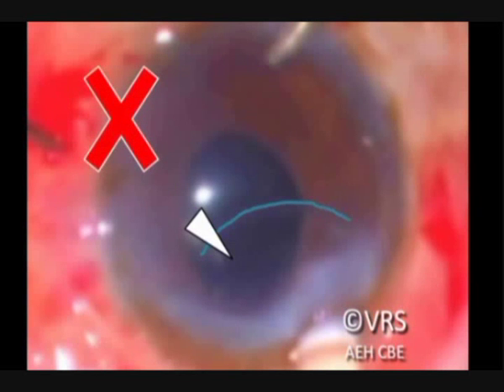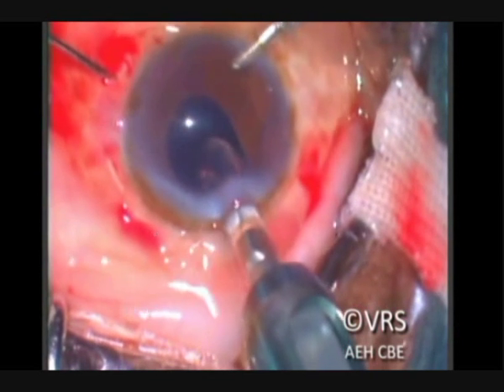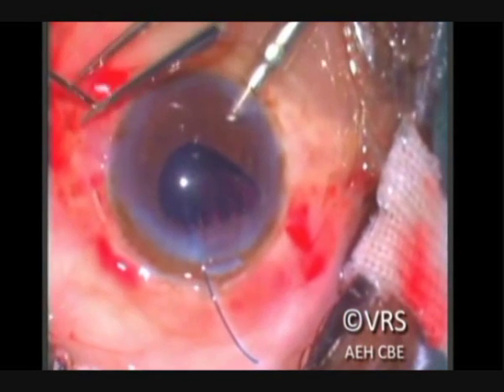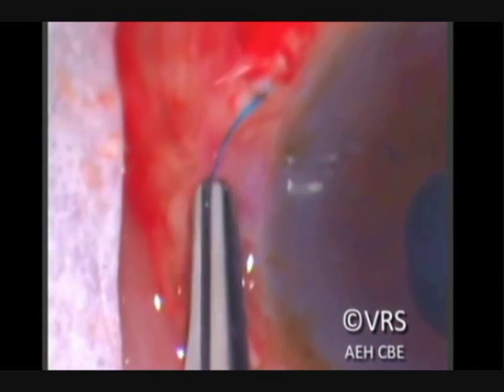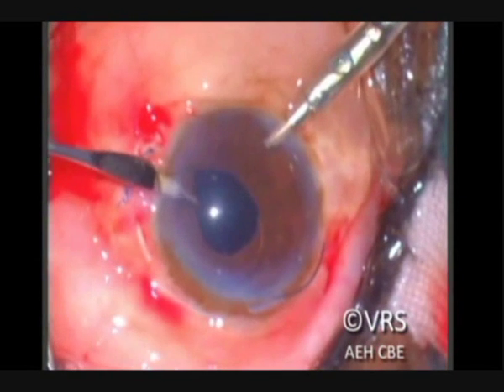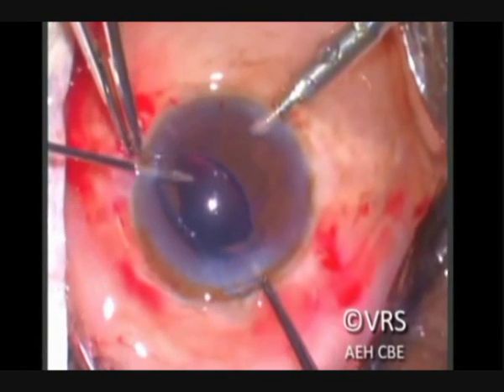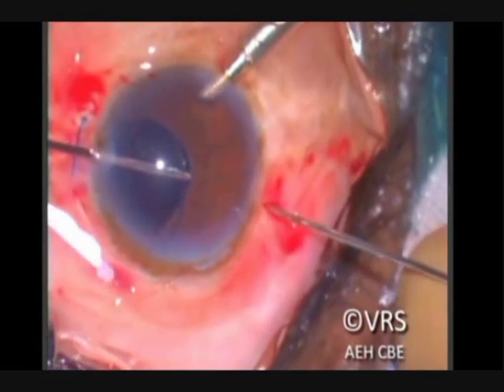The IOL haptic is held and the IOL optic is released into the anterior chamber, leaving the trailing haptic outside the anterior chamber. The leading haptic is then pulled out of the eye. If there is a mild kink because the tip was not held properly, this can be ironed out using a suture holding forceps. A paracentesis is made so that a handshake technique can be used to hold the other haptic. The first IOL haptic is fed into the anterior chamber using McPherson forceps and held by similar forceps from the opposite paracentesis. The Max Grip forceps is then inserted through the sclerotomy on the right side, the very tip is held properly and then externalized.